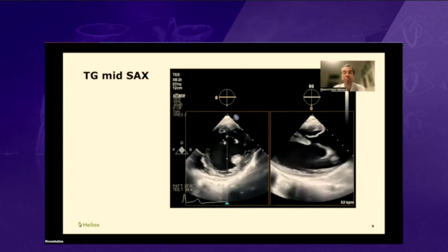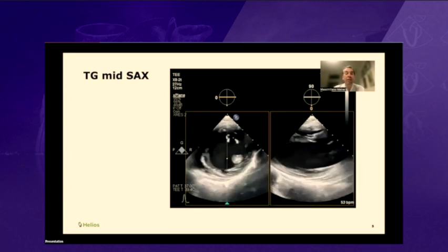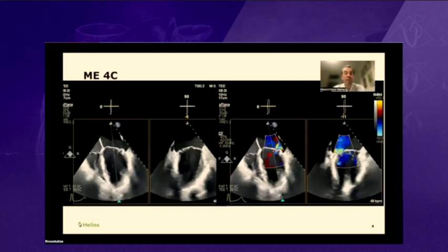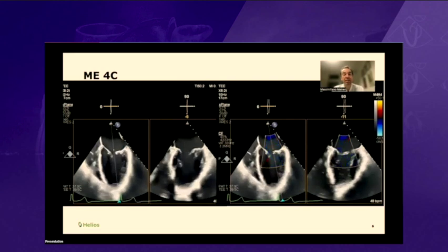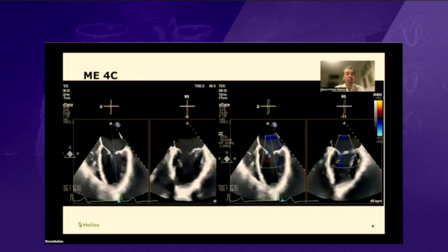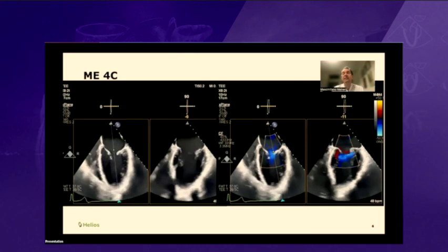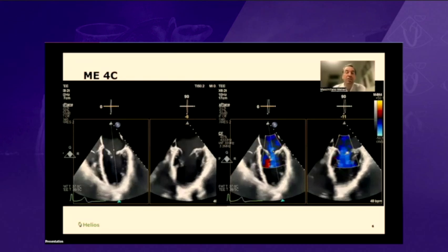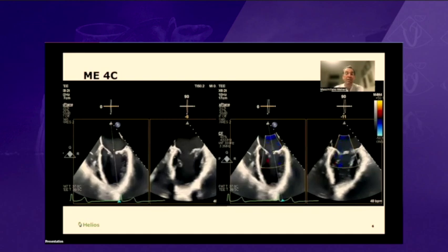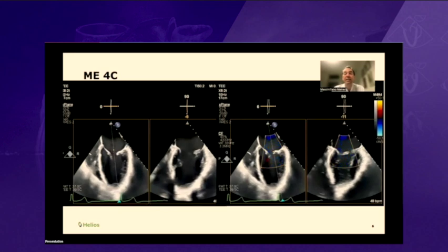This is a short axis view. It's very important to document there is no wall motion abnormality in this patient. We go to a four-chamber view. You can appreciate there is a prolapse in the mitral valve with bileaflet prolapse — both anterior and posterior are prolapsing. There's a normal preserved ejection fraction, although there is high-grade mitral regurgitation, and you can already see a regurgitant jet.